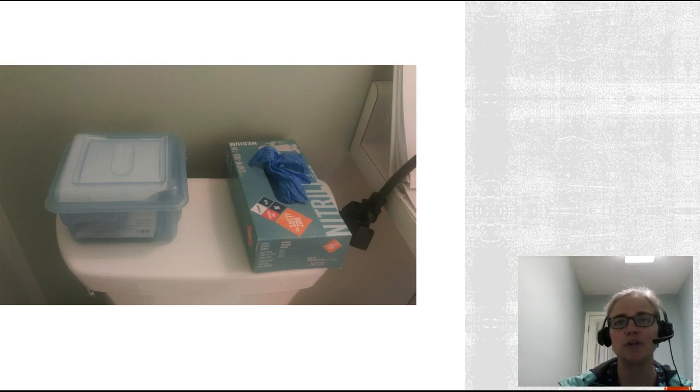Now, most of you have been used to using the FYI pregnancy test, and we're actually changing to a brand called McKesson. It's the same test, it's the same cassette, everything will be the same, it will be read the same, except one little difference will be that the little pipettes that you collect the urine in will come inside the cassette pack. So when you open it up, the little cassette will be in there.